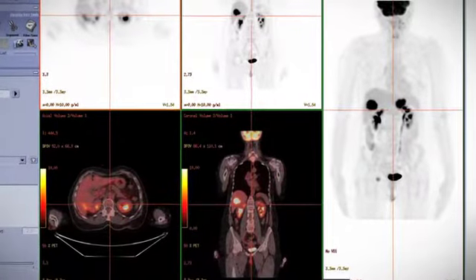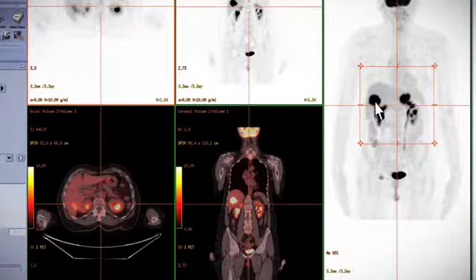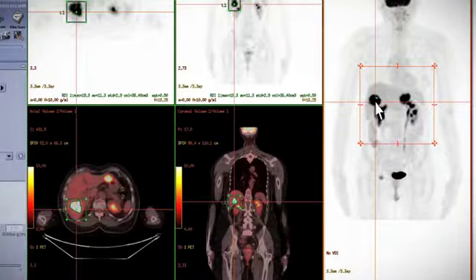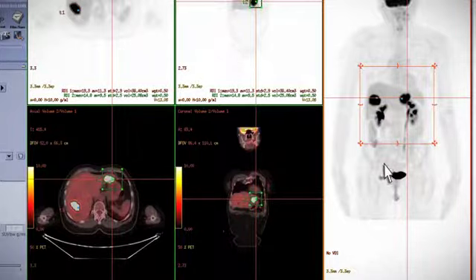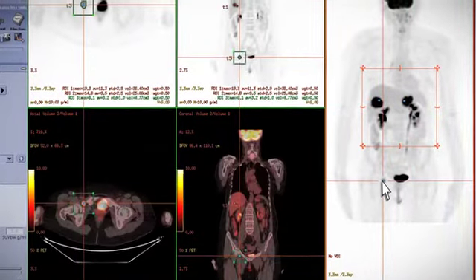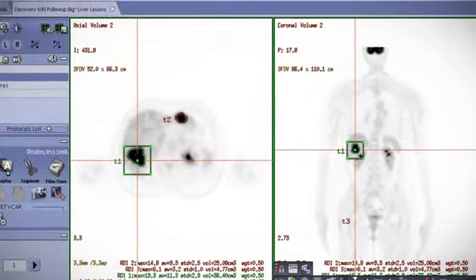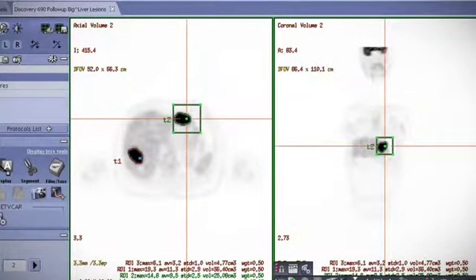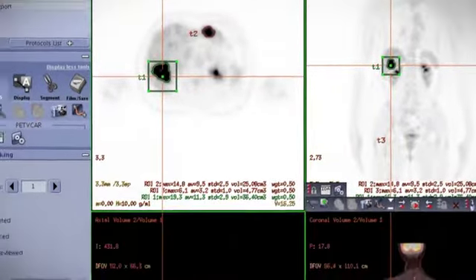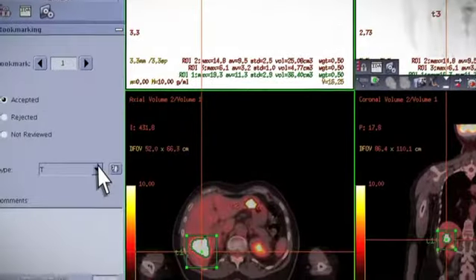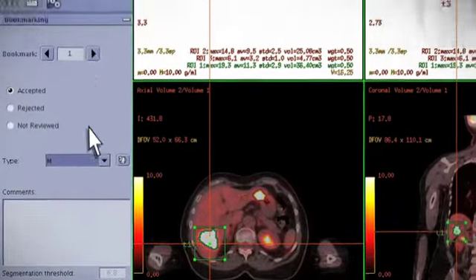Here, you can see that on a baseline PET-CT study, we can identify a lesion and bookmark it by inserting a seed point within the lesion. If the study has multiple lesions, the clinician can easily identify them. We can review them by size and location and classify the lesion as a tumor, node, or metastatic disease.